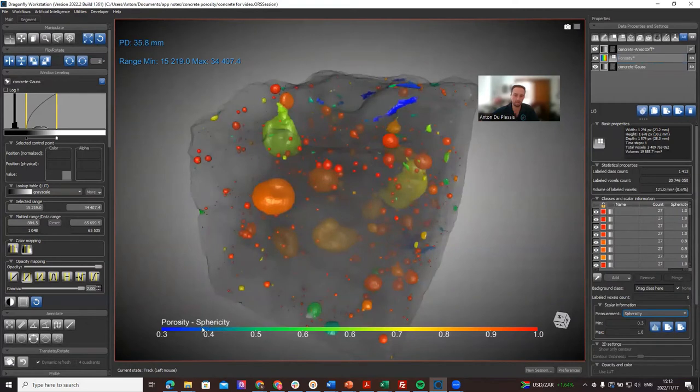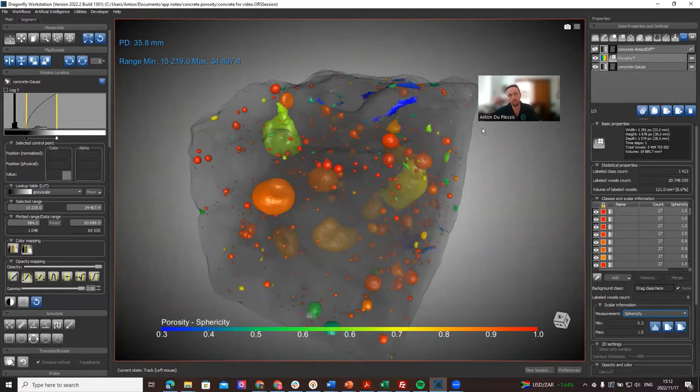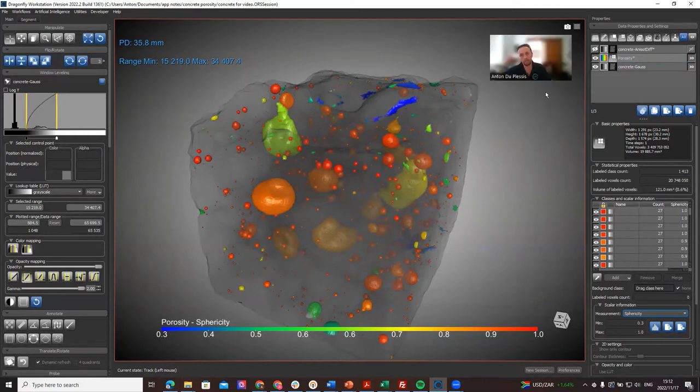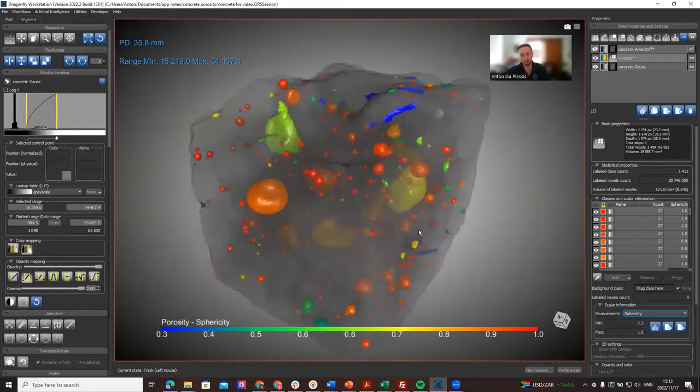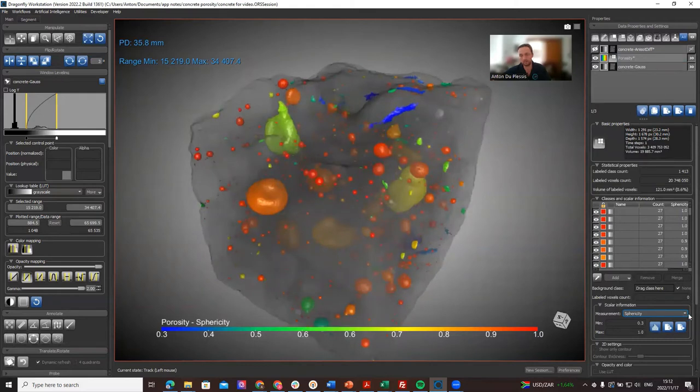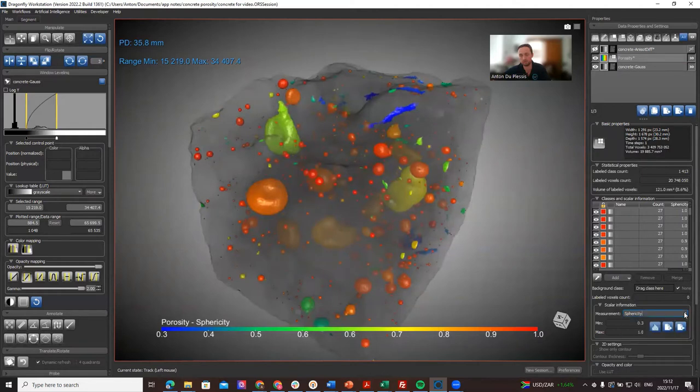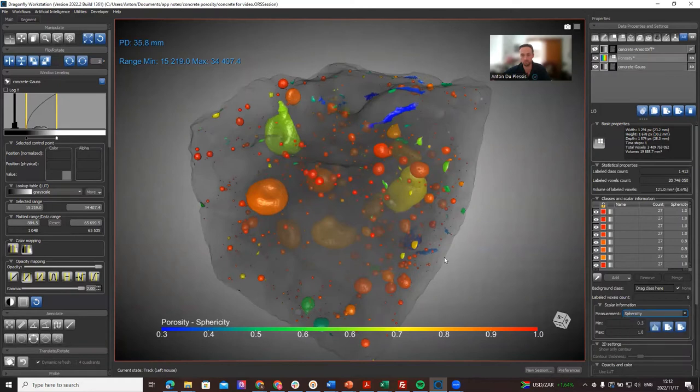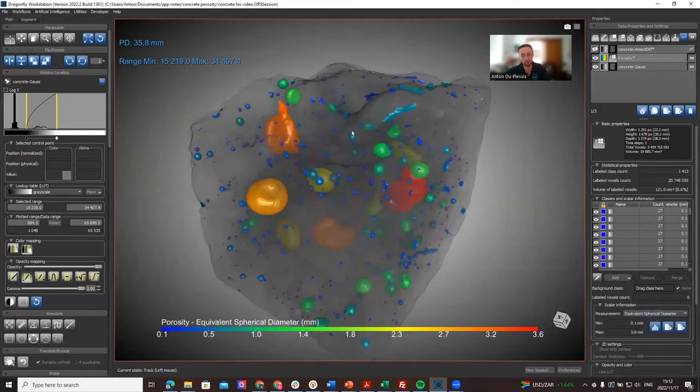The second new feature I want to show you today is related to this. When you have a multi-ROI and you calculate different things like volume and surface area, you can also calculate equivalent spherical diameter for pores. This is a new feature, and this is how the analysis looks like in this case.